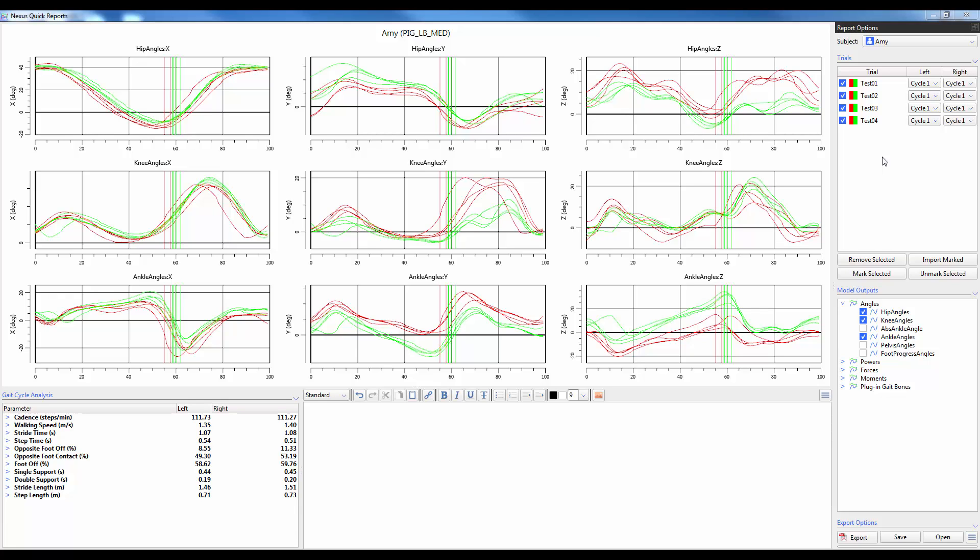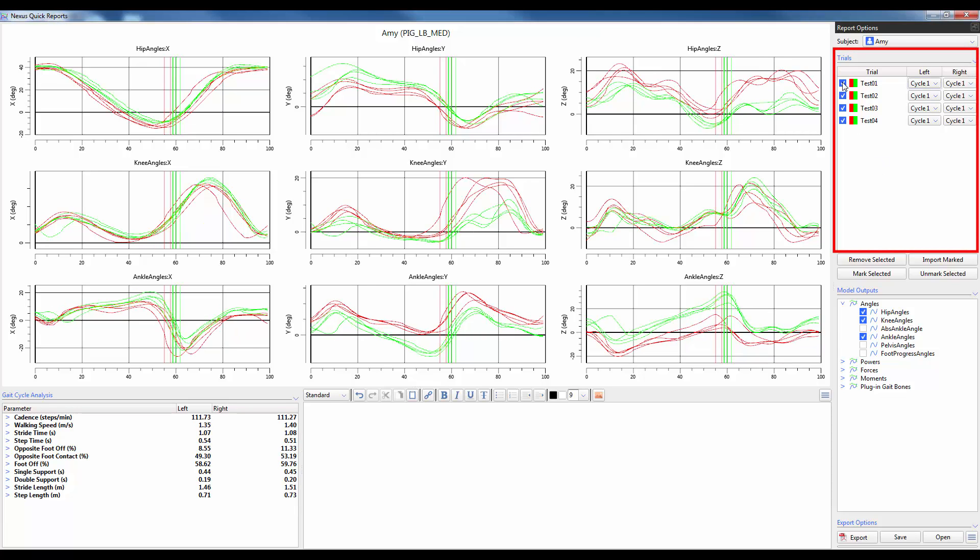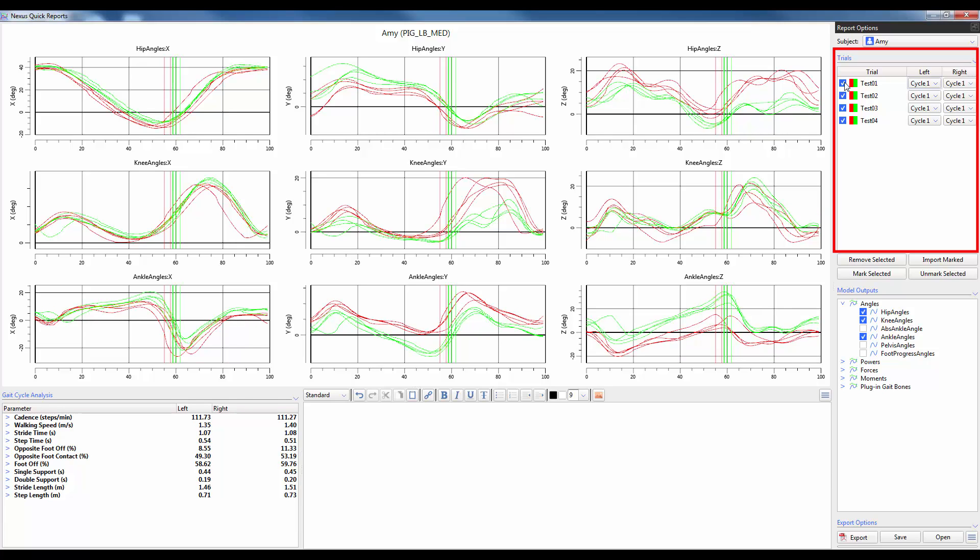In terms of formatting there are a few options available to customize a report. The first is the ability to nominate specific trials and cycles you want to include as part of the report. To remove a trial simply uncheck the box next to the trial name. To change which gait cycle you'd like to use, use the drop down menu for each context of left and right. As you manipulate whether or not you want the trials included or which gait cycle you will also see the gait cycle parameters change in the bottom left corner and the model outputs changed as well in the main window.